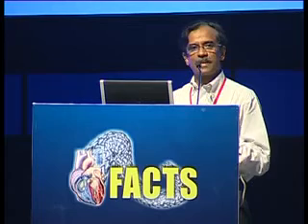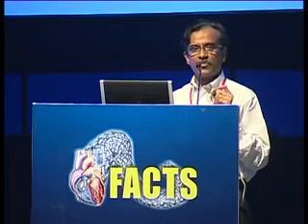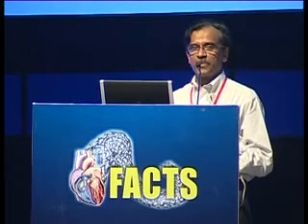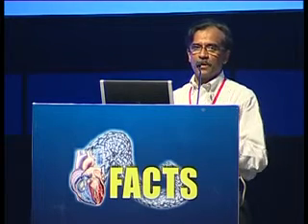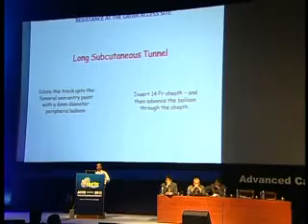Sometimes this may not work, and occasionally we found that if this track is dilated with a 6 millimeter peripheral balloon from the subcutaneous tissue to the entry of the femoral vein, it can help. Very rarely you need a 14 French sheath in the femoral vein to advance the mitral commissurotomy balloon. This scenario is very unusual.